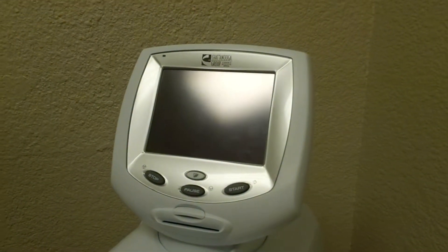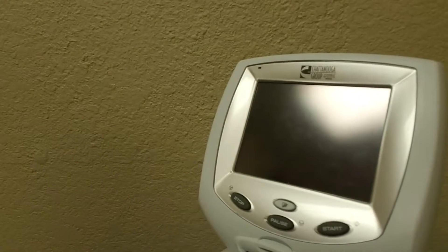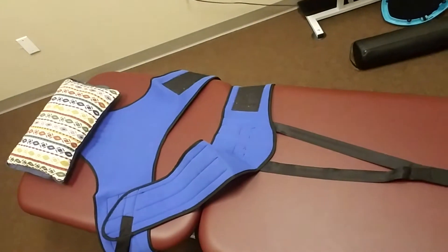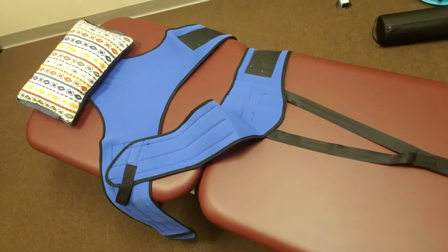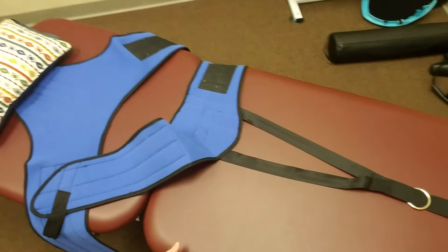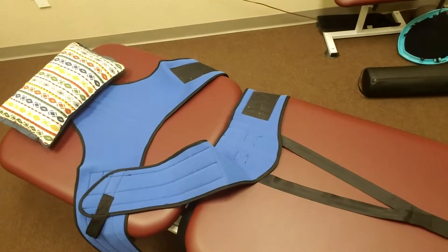I'm going to show you what it does. This is our spinal decompression machine right here. We are very fortunate to have one of the better machines on the market. This is our table — what happens is we strap you into the table and we tilt it to accommodate wherever your particular disc issue may be. This table actually separates right here, which helps with the pulling. When it pulls, it's encouraging that disc to go back within its boundaries and also inviting water to come back into the disc.